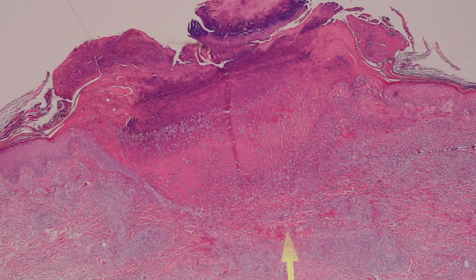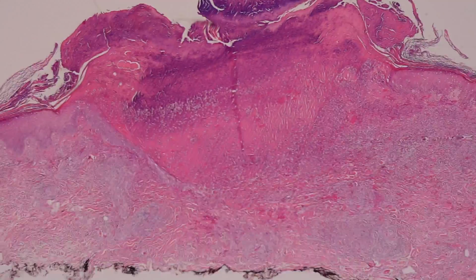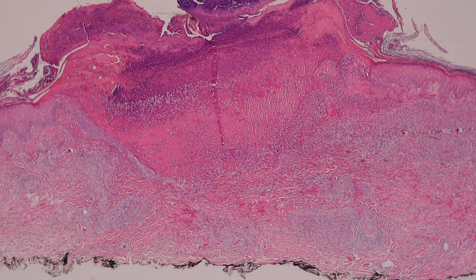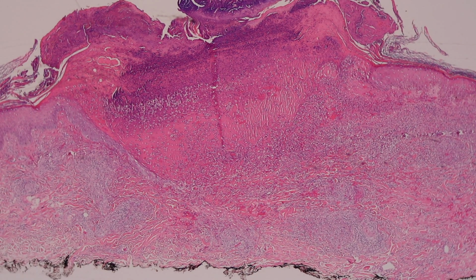And here's another example where the bulla has become so pronounced actually that it's made an ulcer with crust over top. Now let's take a minute to talk about ulcerations and about the lesions themselves, where and how you biopsy. So for those of you who are dermatologists or clinicians watching this, there's some important things to know about vasculitis.